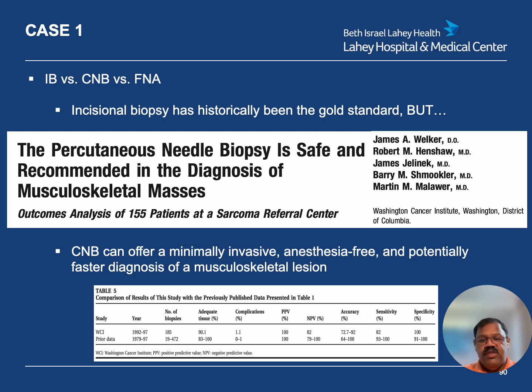So more and more here, at least in the United States, we've migrated towards using core needle biopsies. If this is available to you, if you have access to a core needle biopsy needle, then this would be my recommended approach, especially if you have ultrasound or fluoroscopy or X-ray even available to help position and guide the needle placement. This really helps minimize contamination. And the diagnostic yields are excellent.